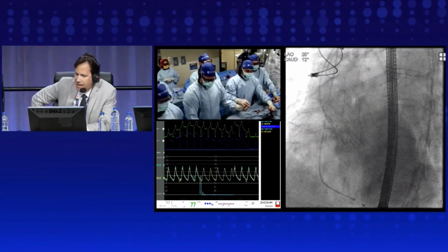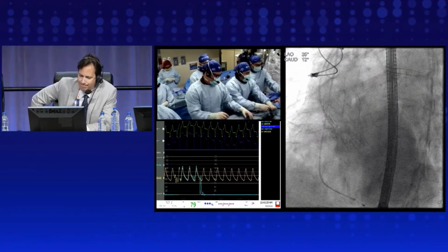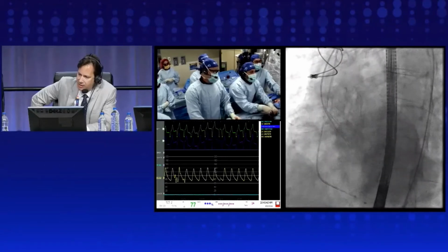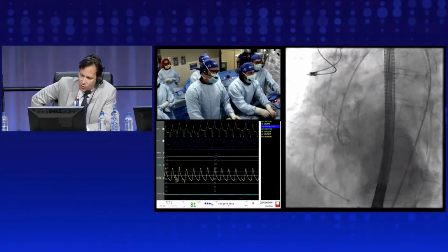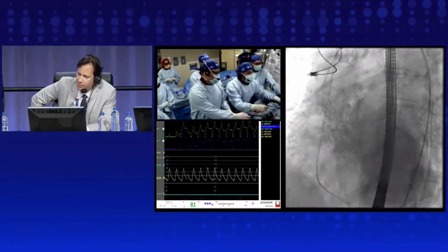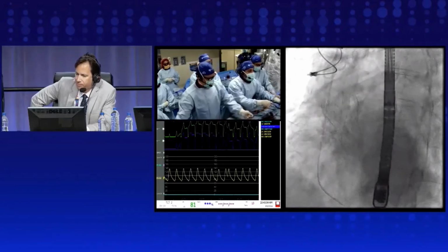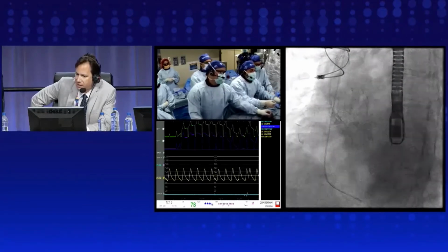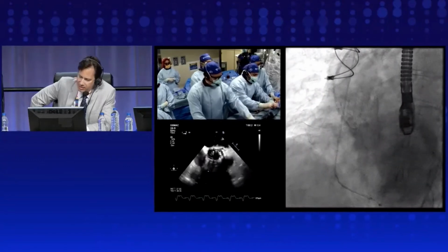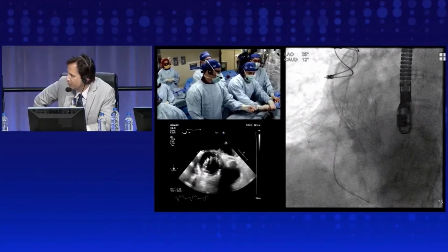The issues with the Sentinel are interesting. In the IDE, about half the patients got a Sentinel device and about half of them had debris in the net. It's unclear what is the increased stroke with Basilica. Certainly in the Lampoon IDE, there were no strokes, albeit it was a native leaflet that was being cut. But I think as opposed to chimney stenting, and the funny thing about this case is that there was a right ostial stent placed for different reasons.